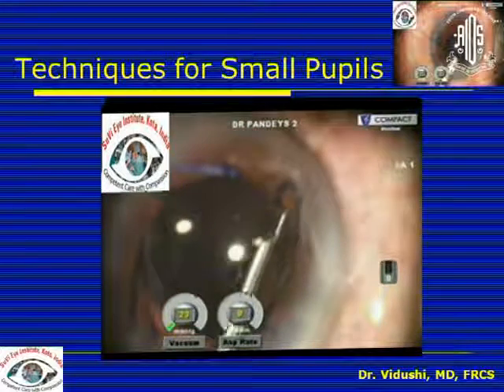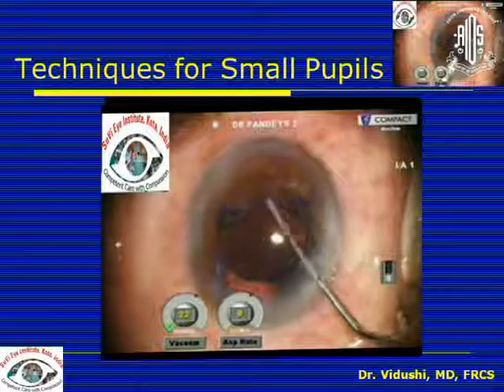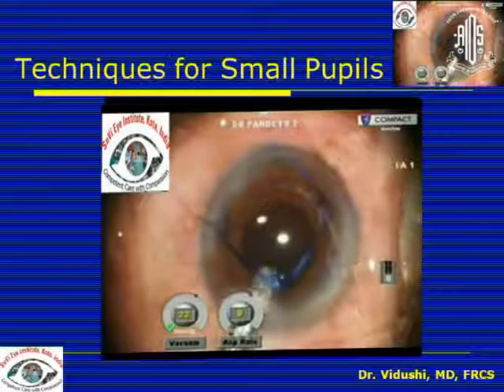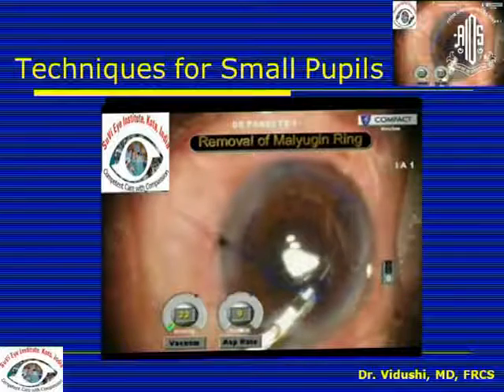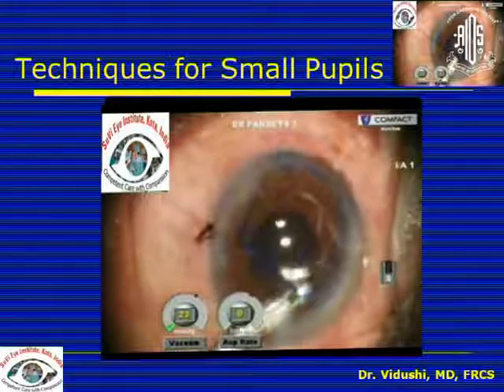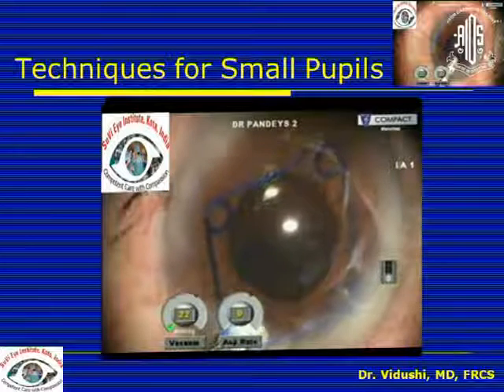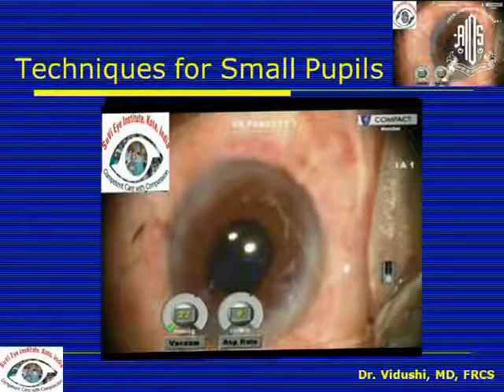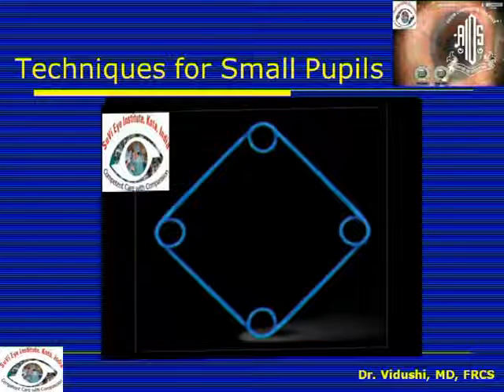Removal of the Mulligan Ring is also equally important and is done through the same injector. First free the scrolls from the iris margin, because during surgery the iris would have become edematous and thicker. There have been reports of iris tear if the scrolls are pulled without care. Free the scrolls, bring the device into the anterior chamber, engage one scroll in the injector, fold the Mulligan Ring within the injector, and bring it out through the main incision. The advantages are no additional incisions, uniform dilatation, and protection of the iris border for 360 degrees.